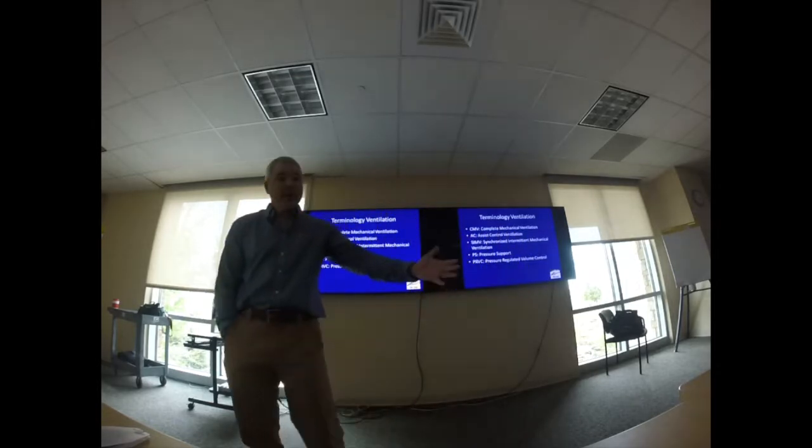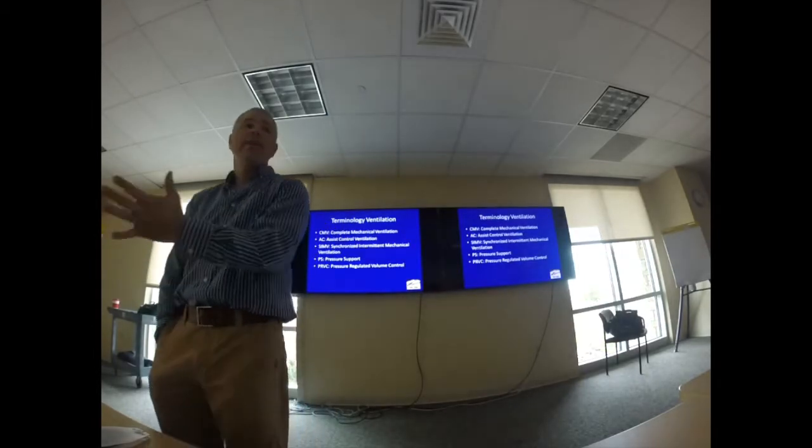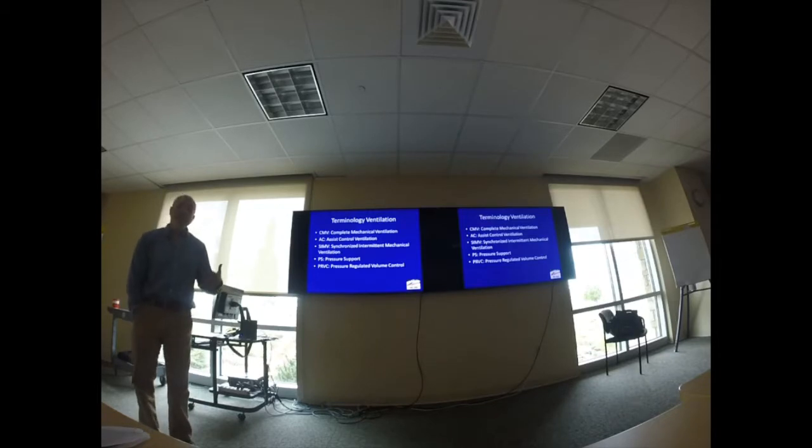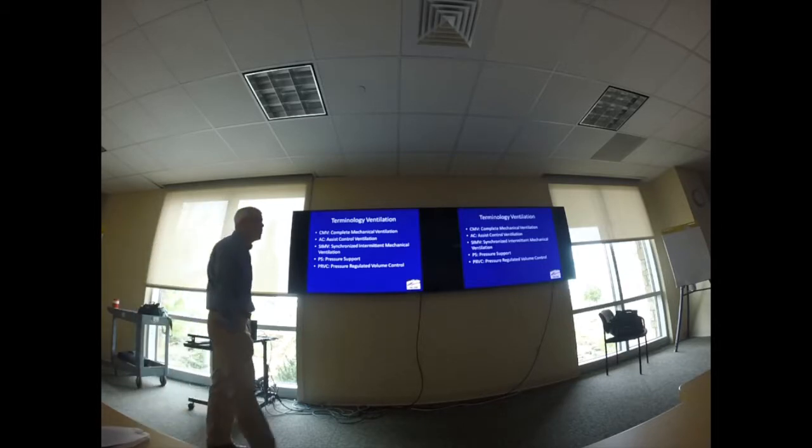So at 12 breaths, it's going to give 500 mLs. At the 13th breath the patient decides to take, he or she can take whatever volume they want. So let's say they only want 250, or let's say they want 300, then they can take that, okay? They don't get that 500 per ventilation.